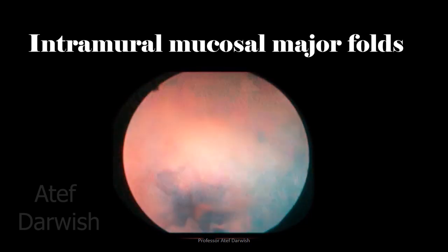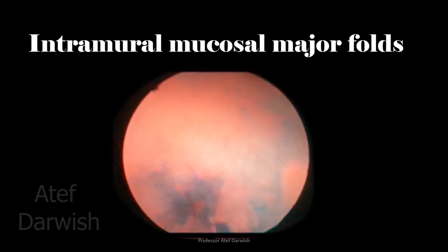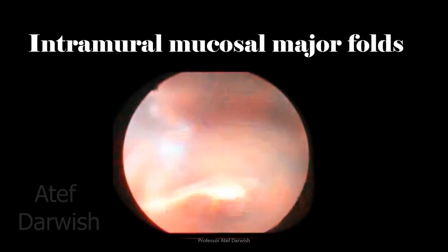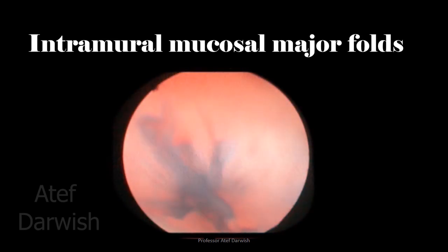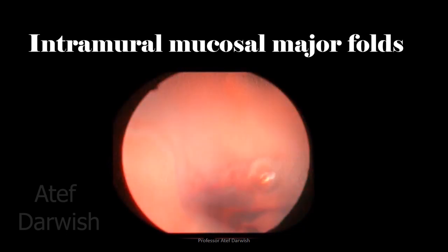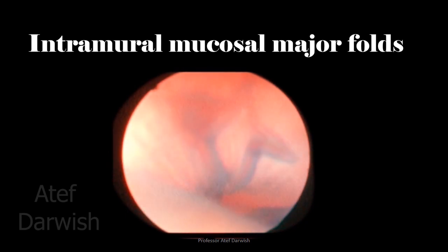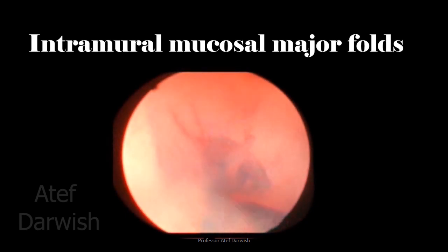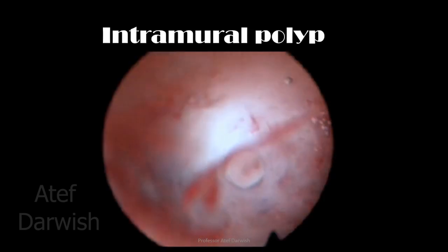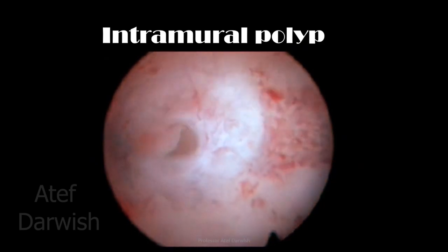As proof that this is part of the fallopian tube and not the endometrial cavity, you can see in this video some endosalpingeal mucosal folds stained by methylene blue. The major folds are seen here in this video to ensure that this is part of the fallopian tube, confirming that you are examining the fallopian tube and have access to it via hysteroscopy.